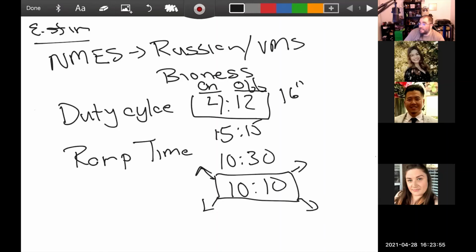I give longer rest periods to newer patients. So if I've got a patient that I'm seeing for the first time, I may do 4 to 12. If I get a kid that's non-compliant, that happens, I may do 4 to 12 because kids don't like this Russian E-stim at all. If I've got a kid with a plantar flexion contracture and I'm trying to use E-stim to move them into dorsiflexion, they do not like E-stim. It hurts.